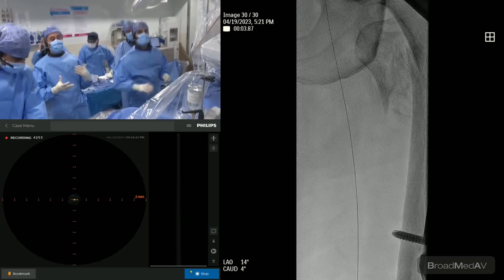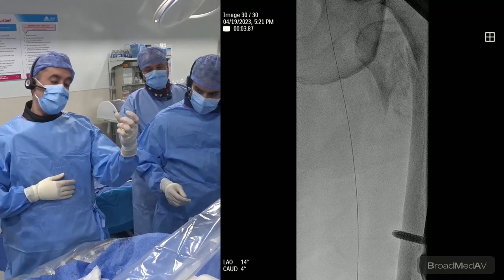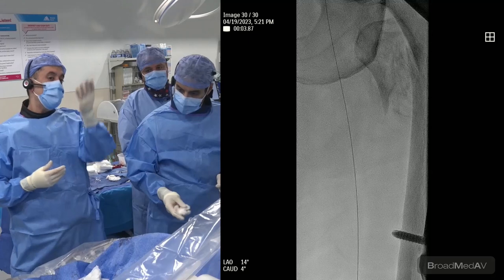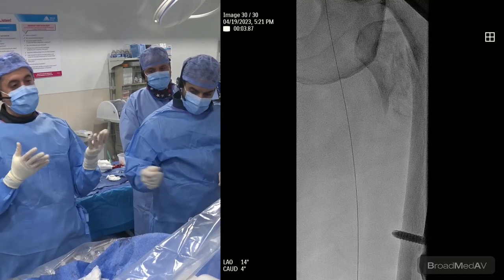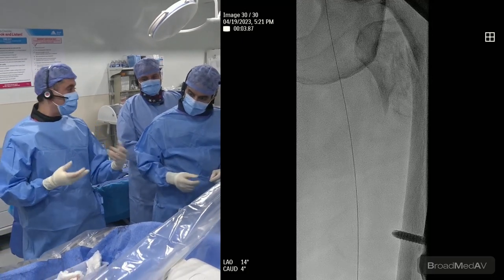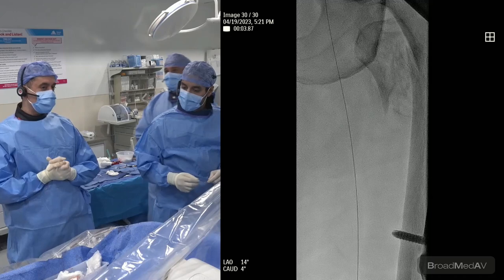Now, the question is the data and not data. The atherectomy data and most of the data in the peripheral world is more anecdotal and retrospective, and not really randomized per se. But in this case, because it's a short segment lesion, trying to get a luminal gain, I would probably just do a directional atherectomy, cut where the plaque is, trying to avoid the normal segment, thereby decreasing the chances of significant dissection, and then hopefully follow it up with a drug-coated balloon. That would be my strategy, and then take it from there, see how it looks.